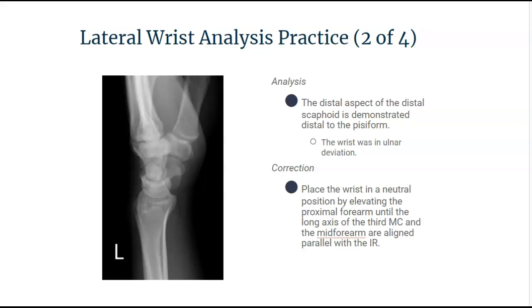Looking at this next wrist projection, it does look like it is in a true lateral projection. However, when we take a closer look, you can see that the distal aspect of the scaphoid is distal to the pisiform. This means that the wrist was in ulnar deviation — that's why the radial and metacarpal articulation is demonstrated as closed as well. So we need to place that wrist in a neutral position by elevating the proximal forearm until the long axis of the third metacarpal and mid-forearm are aligned parallel with the IR.